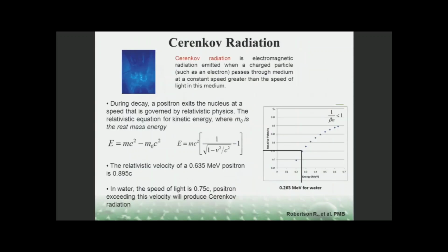As Dr. Gorima already introduced the physics of Cerenkov imaging, what it is about and the basic concept. The key concept is that you need a charged particle which has a very high speed, even higher than the speed of light in that particular medium.